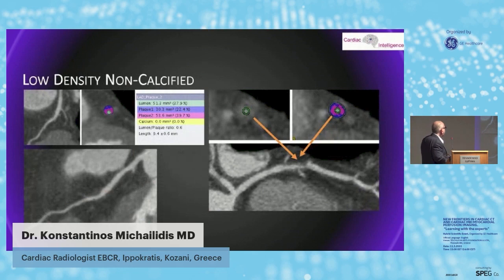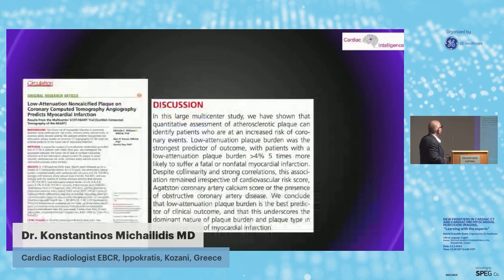And we have the low-density non-calcified plaques that you can see here with the plaque analysis tool. You can even see it with the bare eyes here that there are some areas that are really low attenuation. And these are the typical vulnerable plaques.